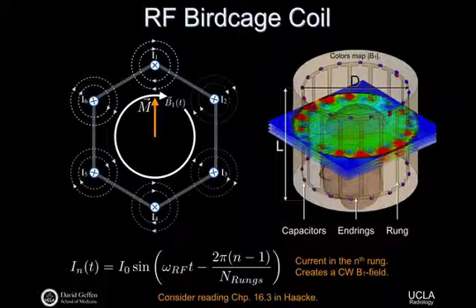Could you clarify again in this figure the direction of the arrow? Is the direction inside the coils? So, which arrows? Is it the XY plane? Yeah, so hopefully I had it in one of the earlier slides, but this would be the transverse plane. This is the XY plane, right?